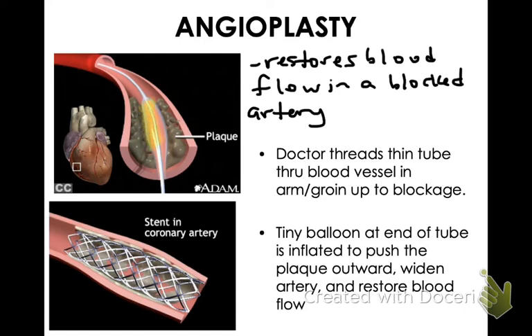So right here you can see they've got this balloon area. They start inflating it, and it pushes out against the walls of the blood vessel, and it also pushes out against the blockage. Oftentimes it's a plaque buildup, which is cholesterol and fatty substances, and it basically squishes all that plaque so that it's not taking up as much space. So then it restores blood flow to that area.